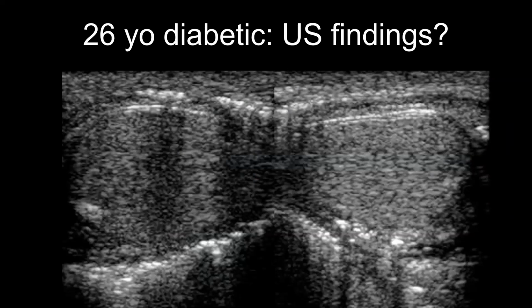So I went and talked to the patient, and it turns out he's diabetic and he was having some constipation and thought he developed a little perianal fissure. And then the next few days, his scrotum became very tender and swollen. So what is the ultrasound finding?